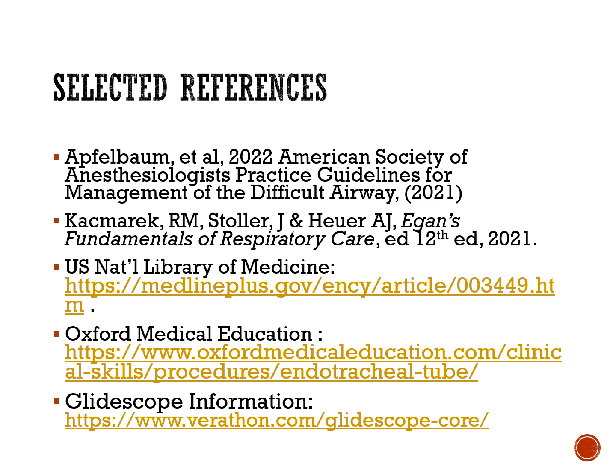They include things like keeping the oxygen, the high flow or the regular nasal cannula, on the patient while you're intubating, just to buy yourself more time. The use of bougies, the use of fiber optic equipment, and a lot of the other things that we talk about in this presentation. So for any of you who are really interested in drilling down more, and you have limited time to do so, that would be the piece I would access.